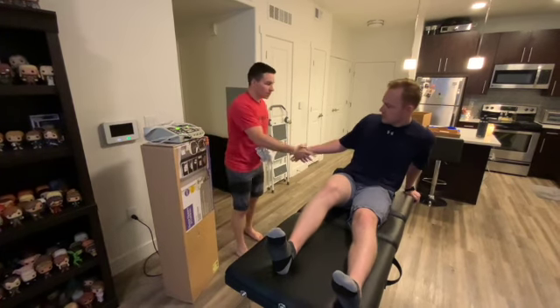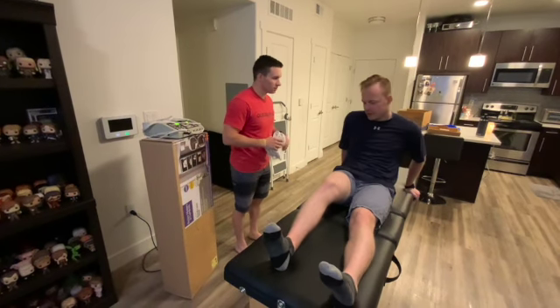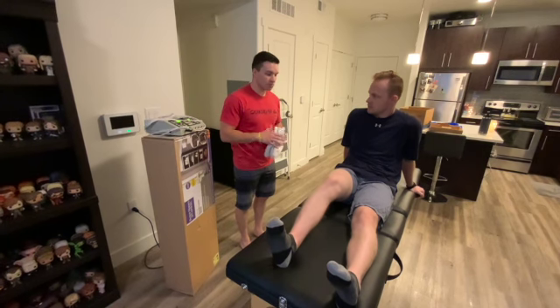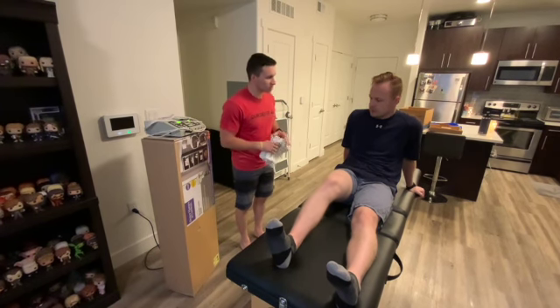Okay, Colton, how are you doing today? Doing well. Is it okay if I call you Colton? Yeah, that's fine. Okay, so Colton, I saw you're coming in here today because you're having some pain in your knee from some osteoarthritis that you've been having.